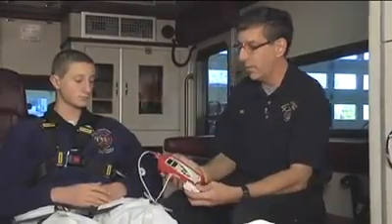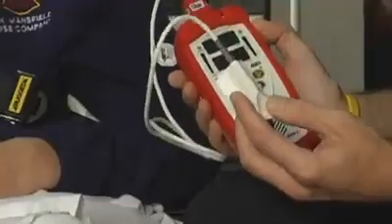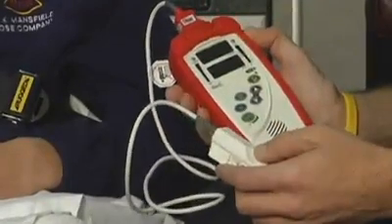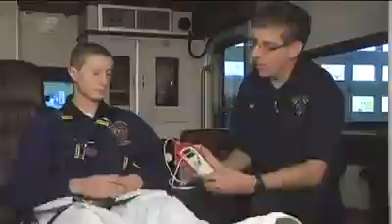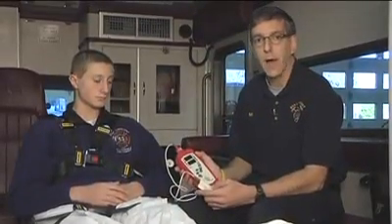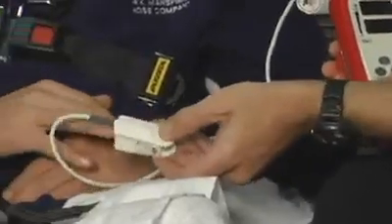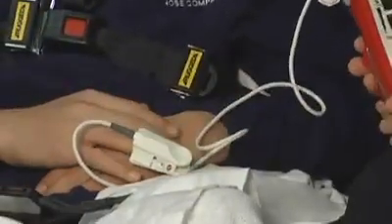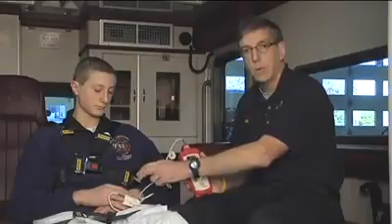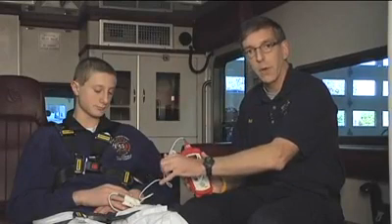The first thing we're going to do is place the probe on the patient. We have a finger probe and we're going to choose a finger that has the best blood flow. Of the fingers on your hand, your ring finger tends to have the highest blood flow, so we'll place the probe on the patient's ring finger. We could put it on any of the other fingers, preferentially one of the three middle fingers — not the thumb, not the pinky.